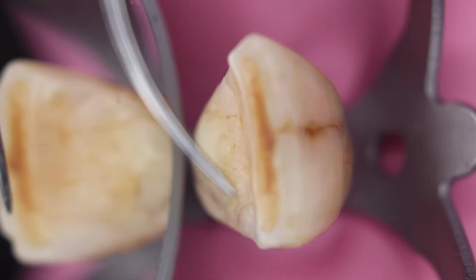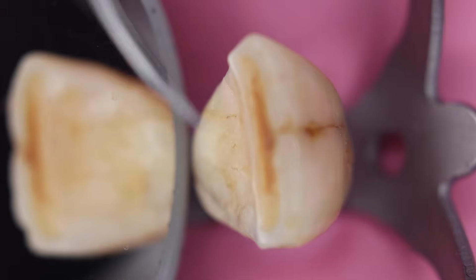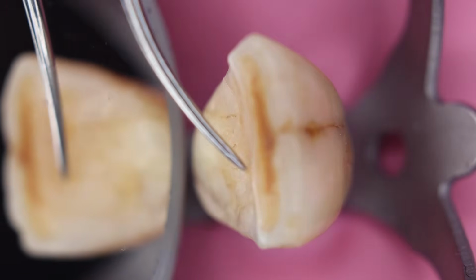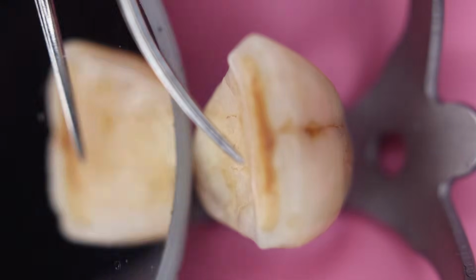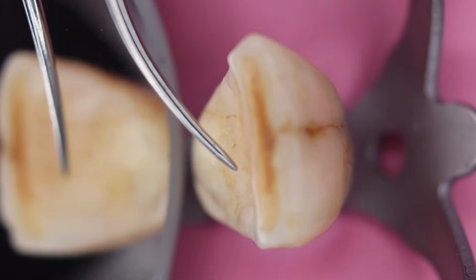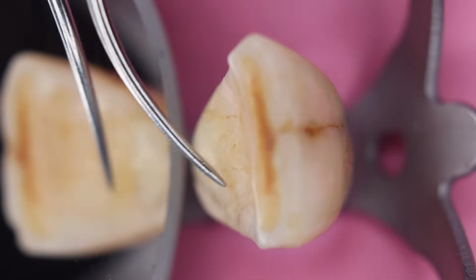Otherwise, in normal situations when the tooth has sound tooth structure, we can approach from the palatal aspect in indirect vision, keeping your position in an erect, good position, so that you can see with the mirror.